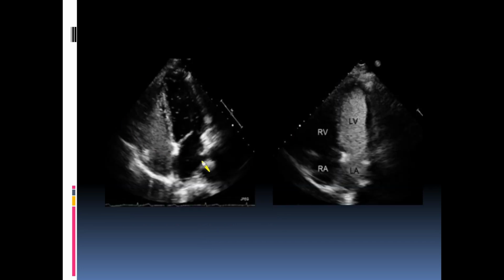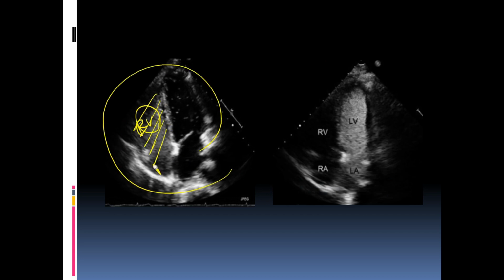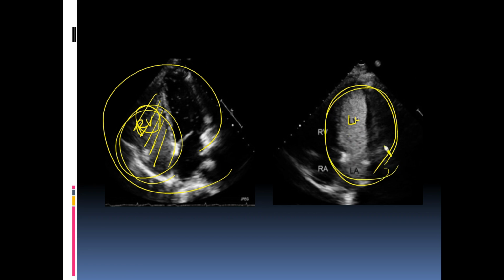If you look at the video, you can see that this area shows the right heart being filled. This is an evaluation using saline. In the video on the side, you can see that the left heart is being filled. For this part, you should note that it is an evaluation using microbubbles. So, depending on the structure or disease you want to evaluate, just remember to distinguish whether you need to use microbubbles or apply saline for the assessment.